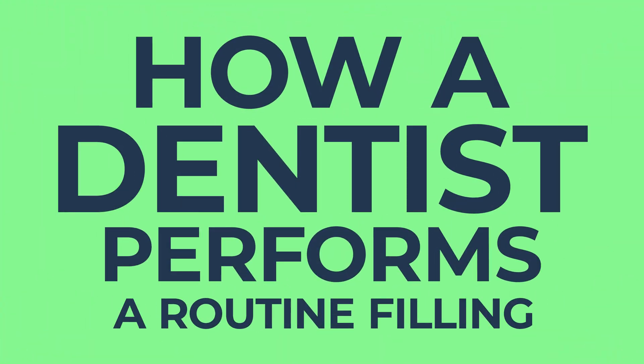I'm Rick Buck and I've been a dentist for 15 years. You're about to see how I perform a routine filling.